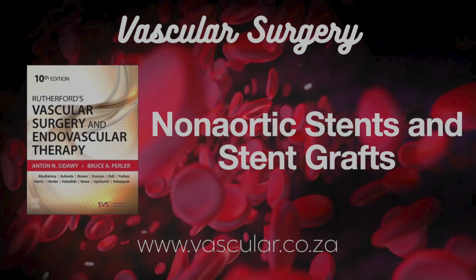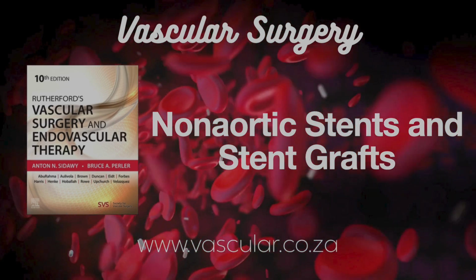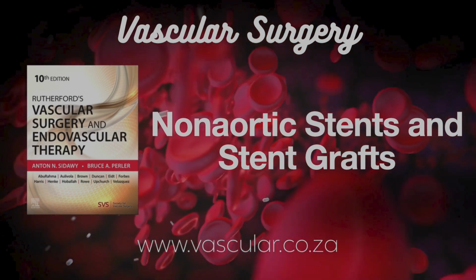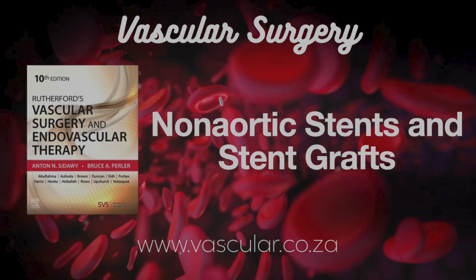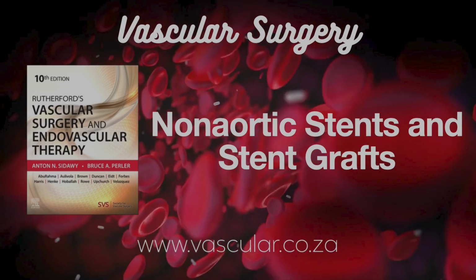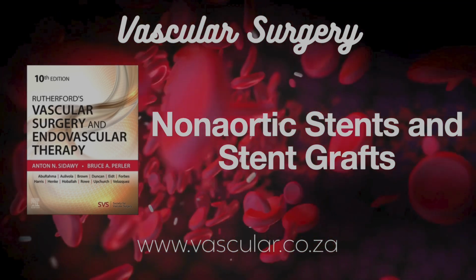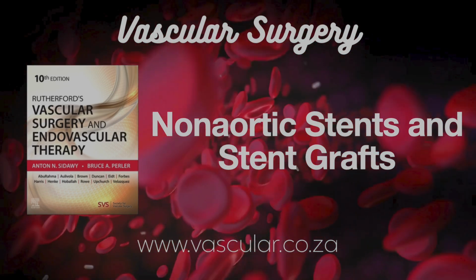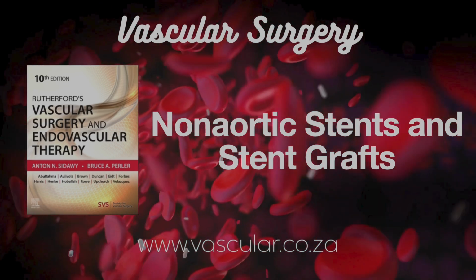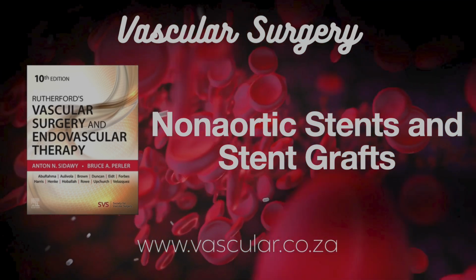Like where SE stents are often used. That's the irony, yeah. Their flexibility makes them good for those spots, but also perhaps more prone to fracture over time. Overlapping stents seem particularly vulnerable. So using longer stents to avoid overlap helps. That's the idea. And corrosion, as we mentioned, can happen too, influenced by the environment, forces, even different metals interacting if stents overlap. Sometimes a covered stent is placed inside an overlap zone to try and prevent that, and these stents can leach metal ions, which might irritate the vessel wall.